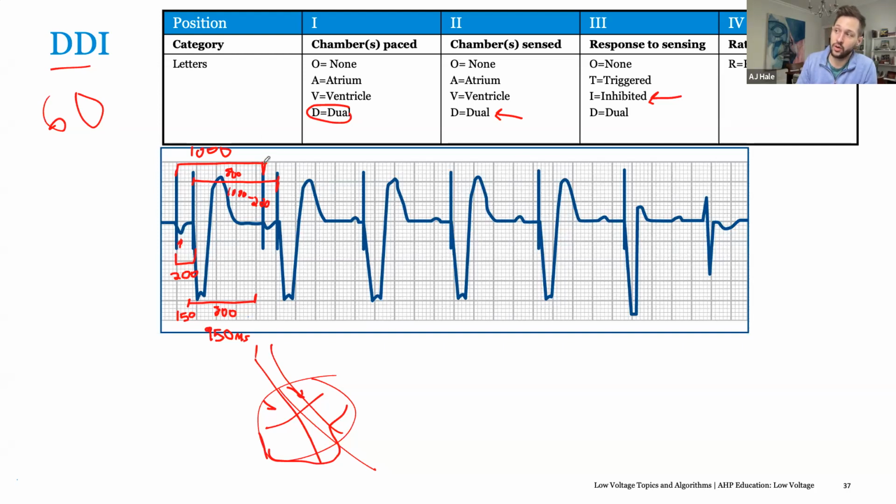So in this case here, our timer starts in the atrium. It's once again based off the ventricle, but it starts in the atrium. An atrial event occurs, and then it waits its AV delay and paces the ventricle. Starts again, an atrial event occurs, so it doesn't pace the atrium. It waits its AV delay, or your V-based timing in this case. So it's still waiting 1,000 milliseconds, and you're starting to see this prolongation of your PR interval. We're seeing this occur here, where it gets worse and worse until eventually their intrinsic activity comes across. So we're still waiting our 1,000 milliseconds.